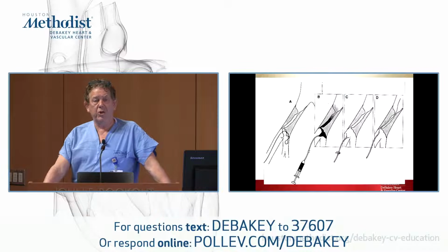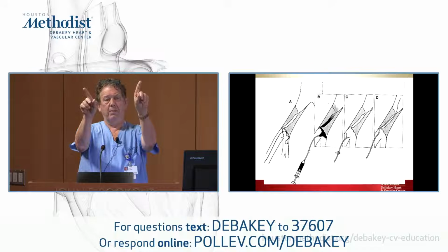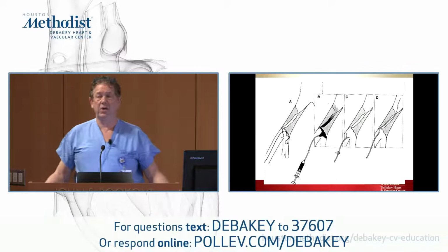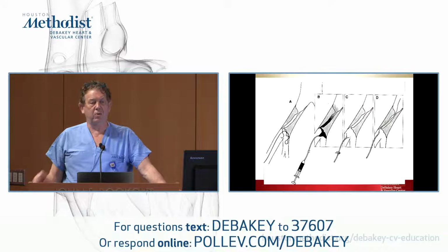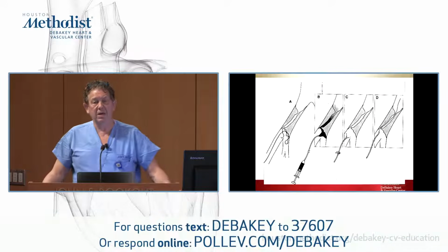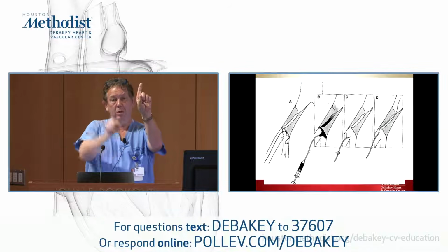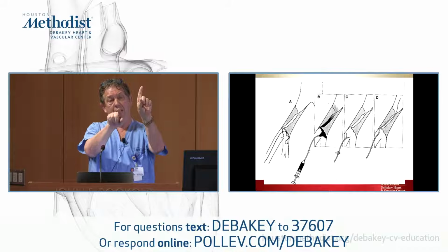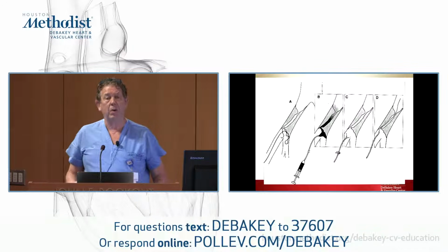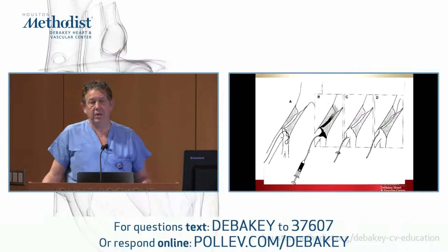When you're doing a carotid stent, that takeoff angle of the carotid is incredibly important. If the internal carotid is a straight shot, in other words, almost like a continuation of the carotid artery, and there's a long, narrow stenosis, you're probably going to be able to cross that pretty easily. If, on the other hand, the internal carotid comes off at a right angle, you've got to turn that wire at a right angle, and now with a right angle catheter or wire you're trying to manipulate a wire through a stenosis, then that is a lot more complicated, and sometimes you can't actually do it.